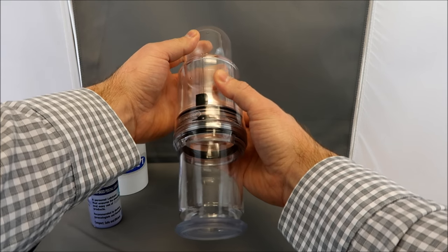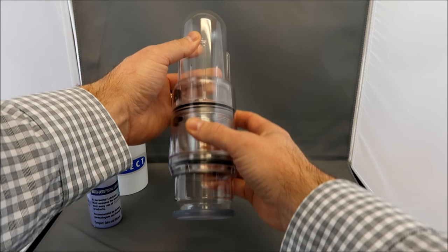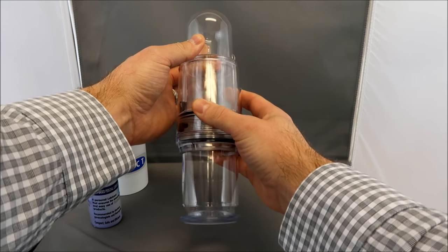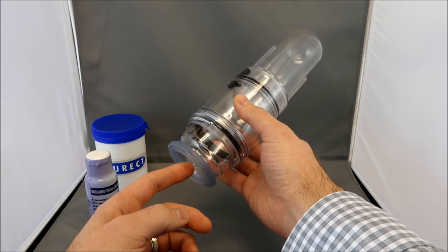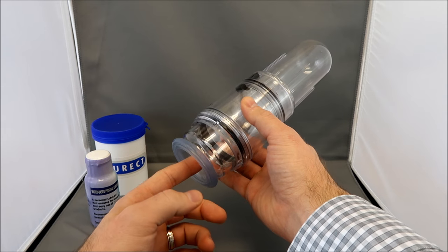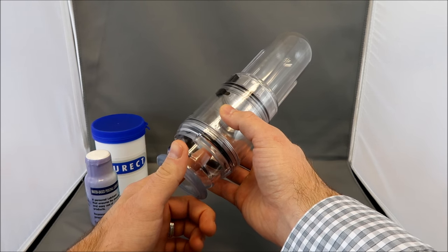Slide the sleeve up and down to create the vacuum pressure. The head of the penis will begin to be drawn through the tension system and into the cylinder as you achieve the erection.